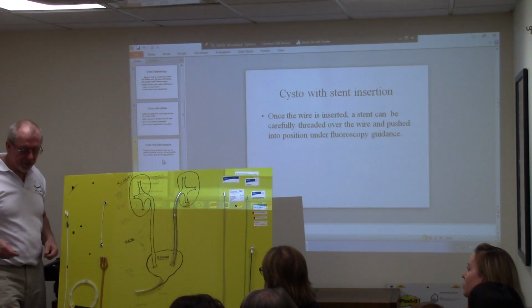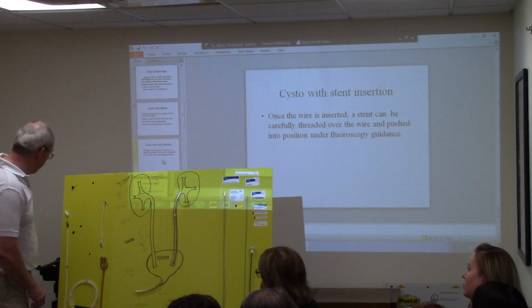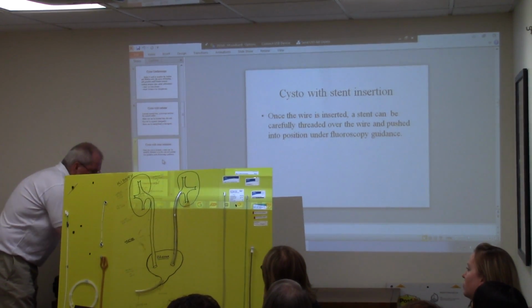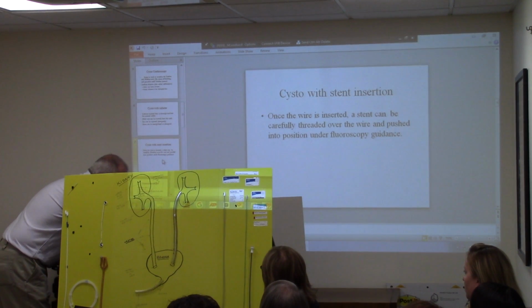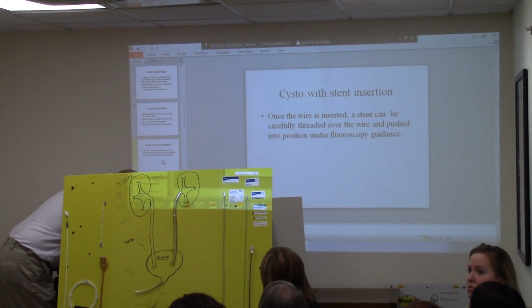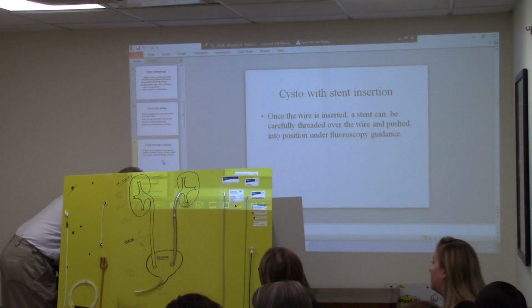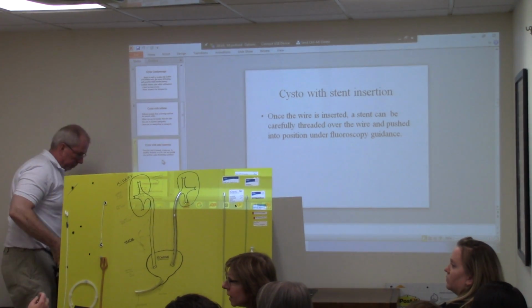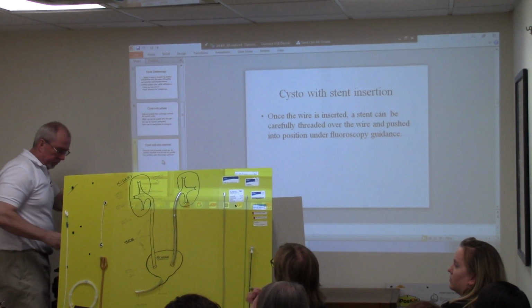And we have little grasping forceps that do that. Here it is here.